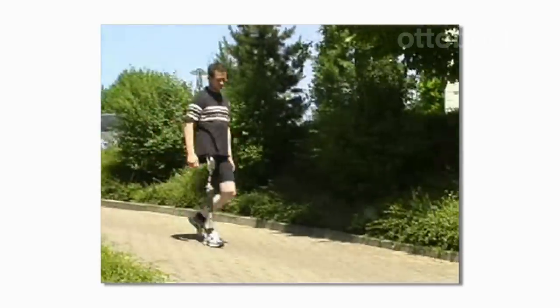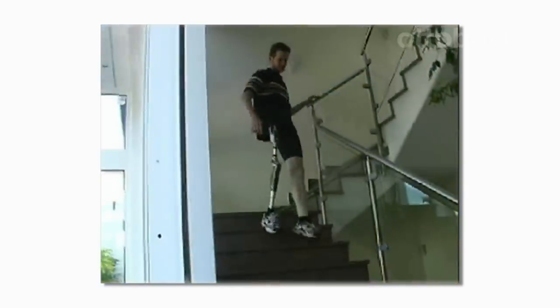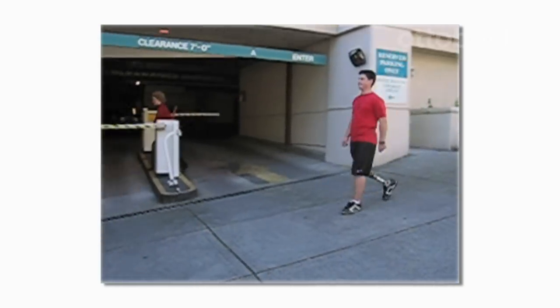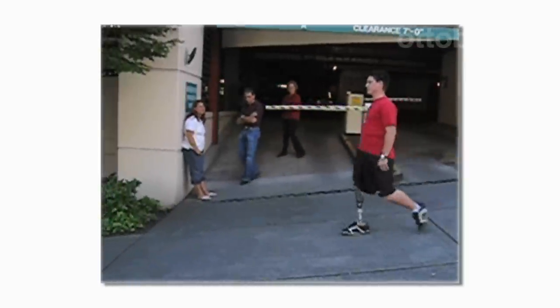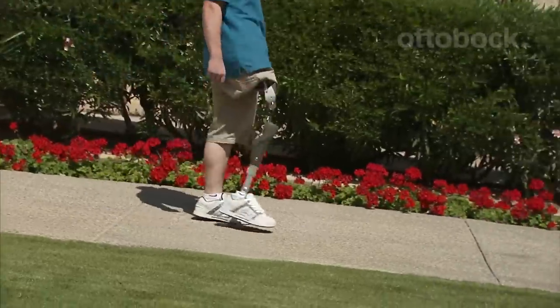Because the Helix bends early at the same time the knee is bending, you get the confidence of knowing your prosthetic leg will swing through with less chance of catching and stumbling. For you, this translates into fewer awkward motions while walking. The Helix creates a more natural, and above all, more secure way to walk.